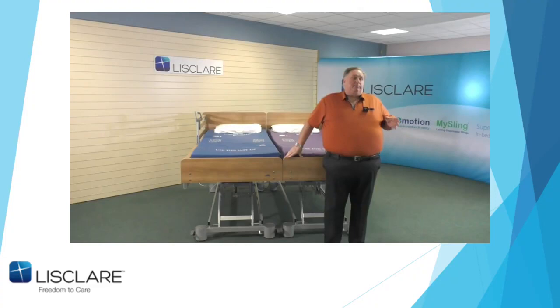In the past, my biggest problem was built-in wardrobes, and everybody has the double bed mindset. Well, a double bed can be 4'6", 5 foot, 5'6". As you can see, this is just over 2 meters of a bed, which needs 2.5 meters working space. Because now you could come out from the fitted wardrobe and split, but you want to make the caregiver's job a bit easier, so you want to maximise the space.